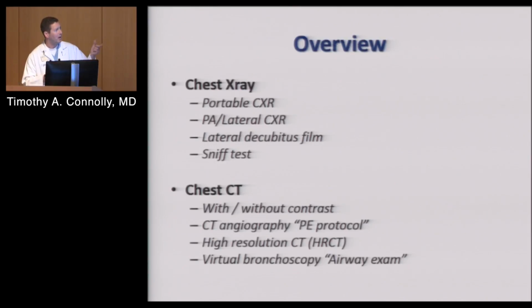We're going to get into possibly at the end just some virtual bronchoscopy, maybe a snippet of seeing what a superdimension, the electromagnetic navigation bronchoscopy, how we use that as a modality, VQ scan, ultrasound. I'll show you just some quick images just so you're familiar with what we look at on a regular basis. But I think these are the two that you have to understand and we've got to go through and focus on.